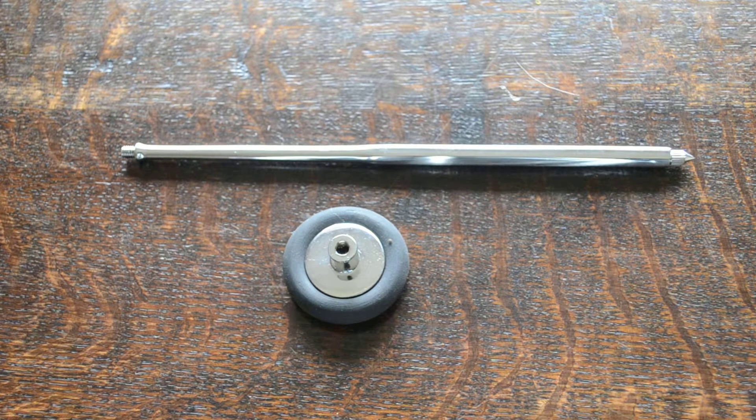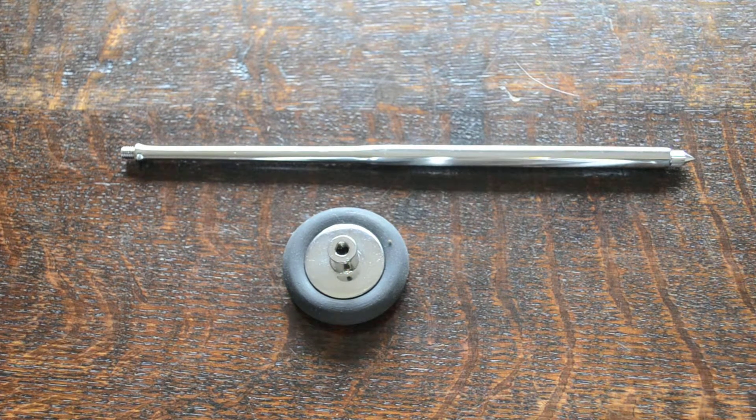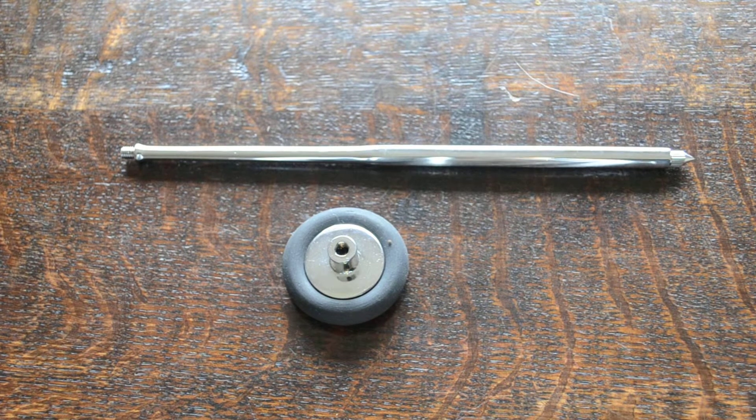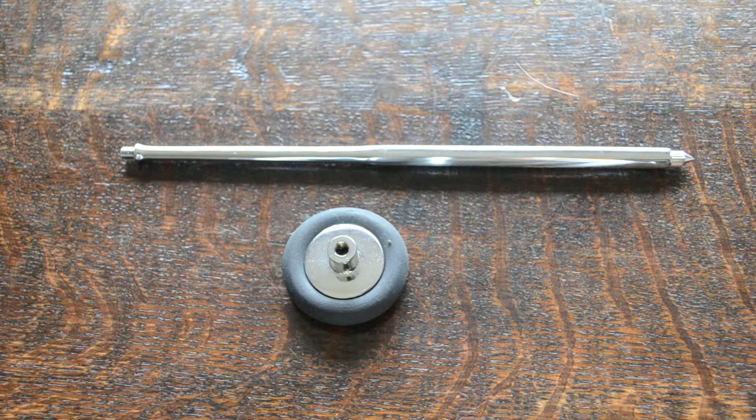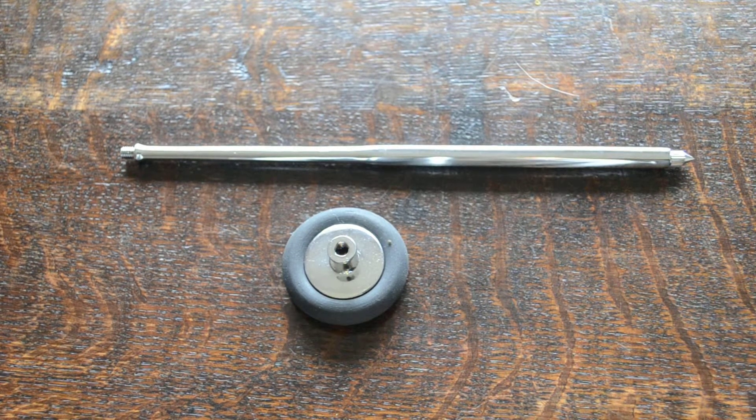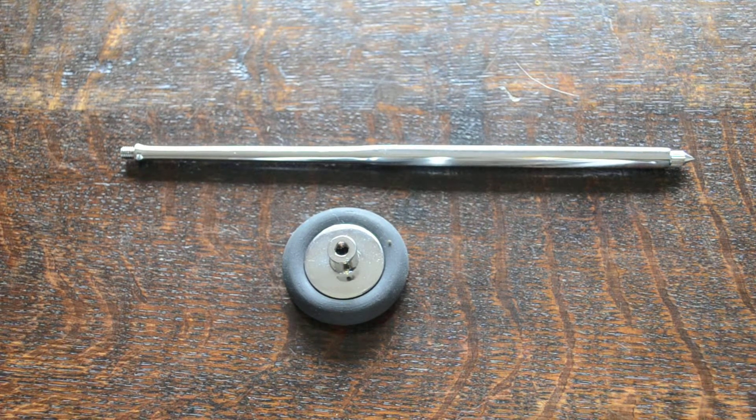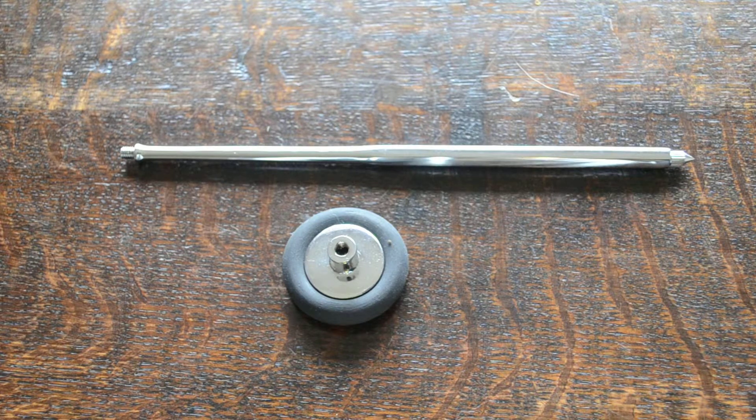Welcome to this presentation where we're going to demonstrate for you the new Valumed Queen Square Babinski reflex hammer. This is new in stock on the Valumed website.